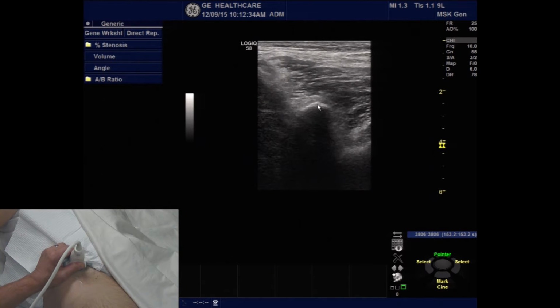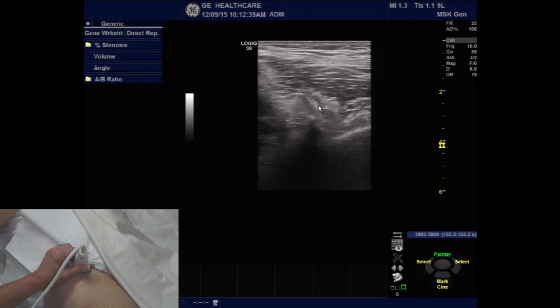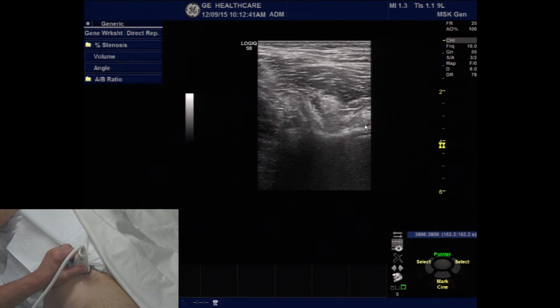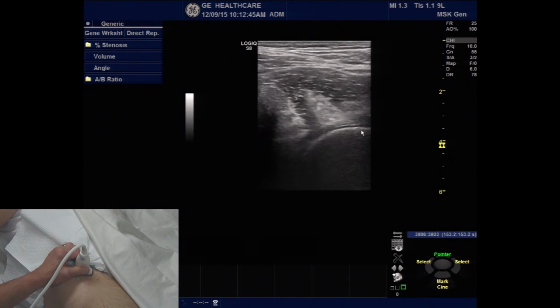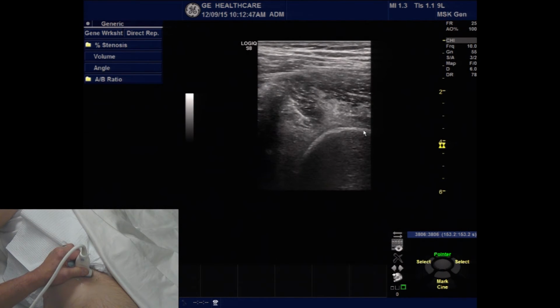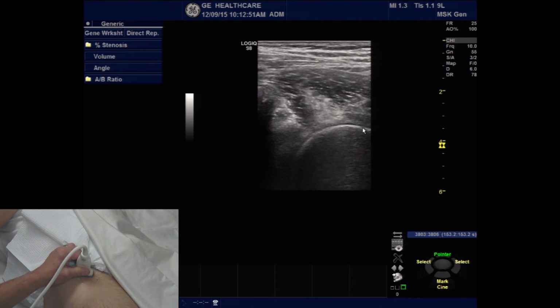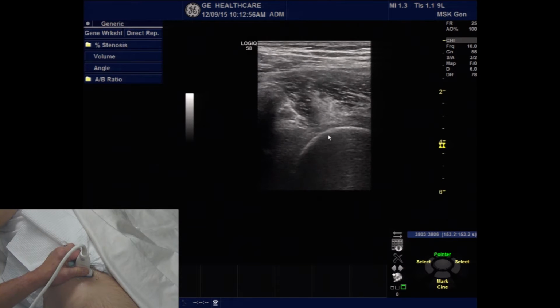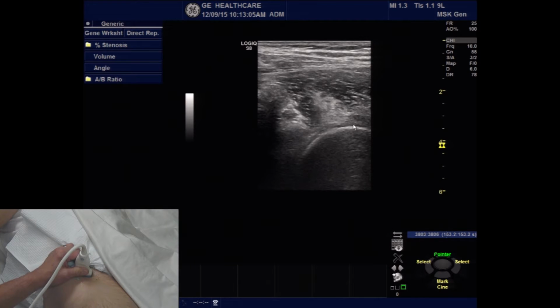So following the bone structure, I'm going to slide the transducer slightly inferior and medial, so the anterior inferior iliac spine is going to slope away. Then I'm going to get into the flat portion of the acetabulum, and as I continue the downward projection, we're going to see the rounded portion of the femoral head, and I know I'm on the femoral head because of its configuration, but also you can see the cartilage that is adherent to the femoral head at this point.